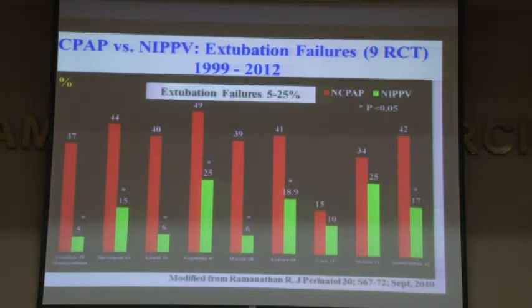So significantly less extubation failures in the NIPPV compared to nasal CPAP. No question about that. You can see 1, 2, 3, 4, 5, 6, 7 of the 9 studies show statistically significant decrease in extubation failures with NIPPV compared to nasal CPAP.